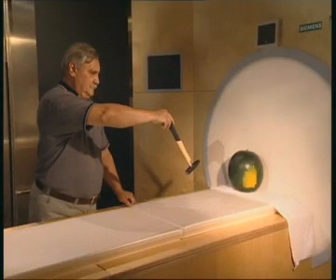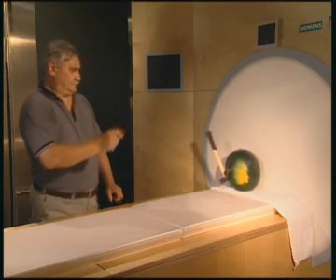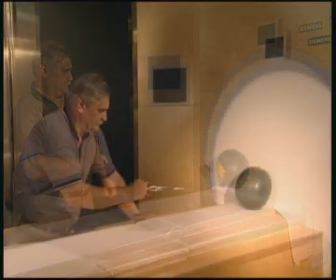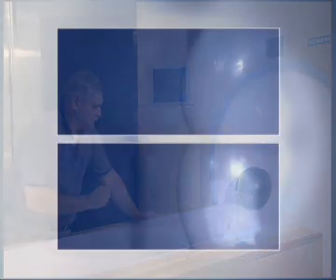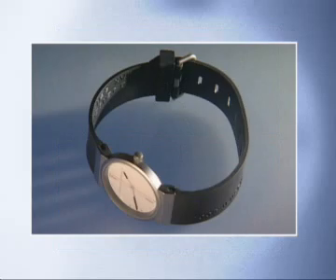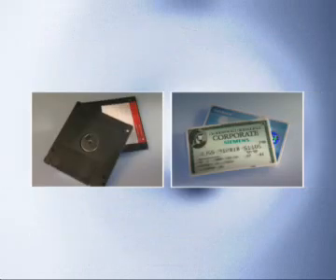This melon simulates a patient's head. A hammer is accelerated toward the magnet and becomes a dangerous projectile. The magnetic field also influences watches, magnetic data storage media, and precision mechanical devices.